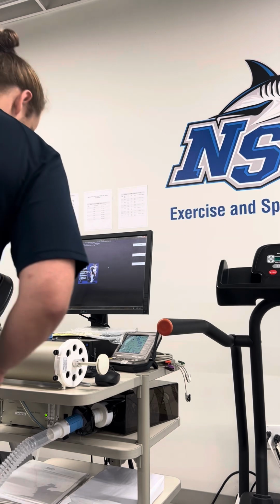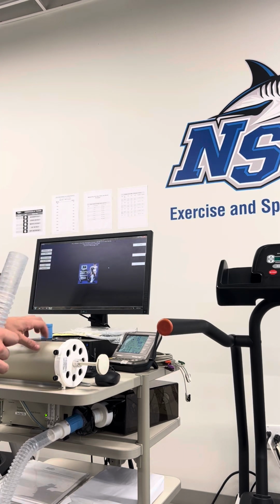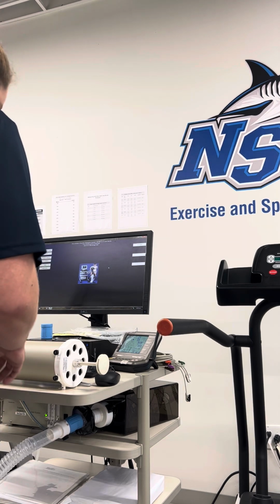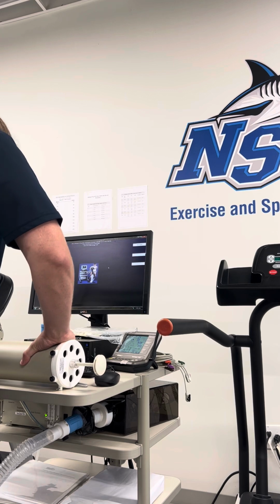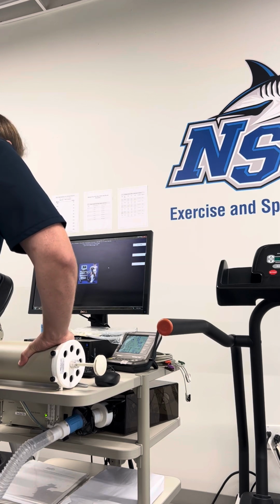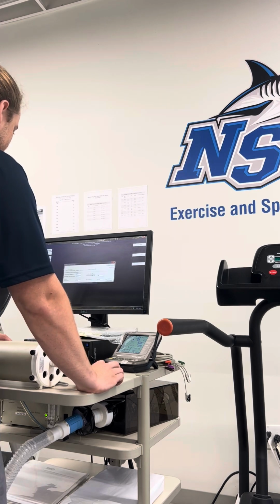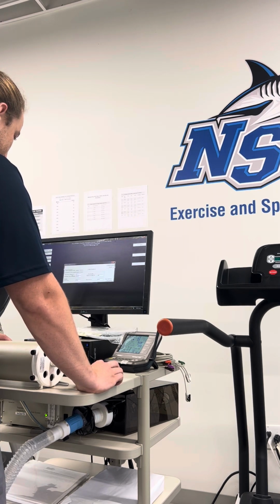Okay, next step is flow meter calibration. I'm going to take my 3 liter syringe, which is equivalent to an average lung size. That's why this is 3 liters. The average lung size is 3 liters, at least how much air it can expire. So, flow meter calibration. Again, I double check my temperature, my relative humidity, everything, sample baseline.